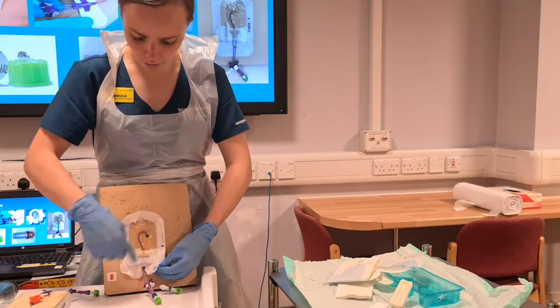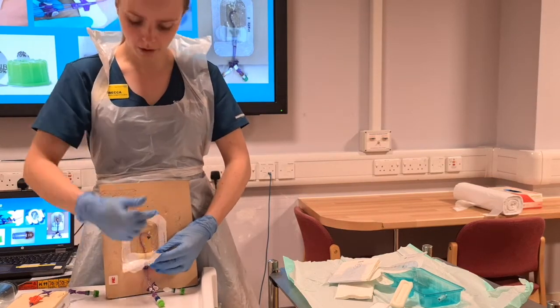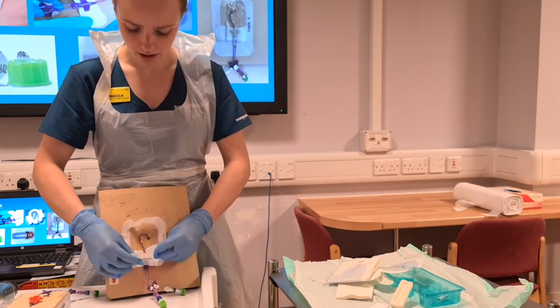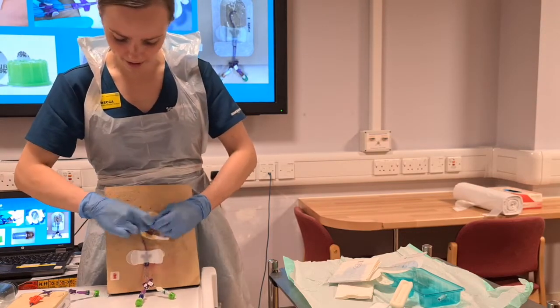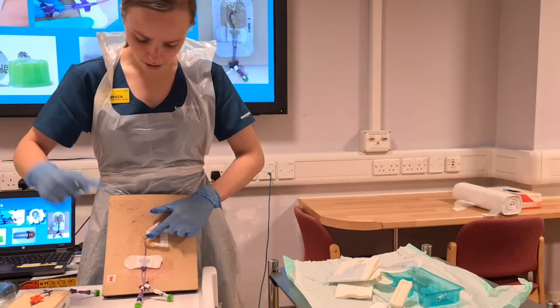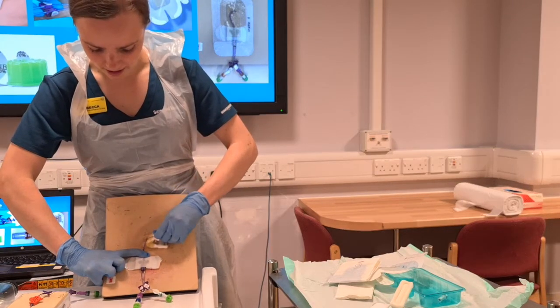Right, so I've gone all the way around the outside. Now I'm going to go up. Always go up. If you go down, you're more than likely to pull the line out. So go up, rolling it up. Go in the way in which the PICC line is going. Mine's going in a bit of a curve. You can touch the PICC line, but just don't touch the insertion site.